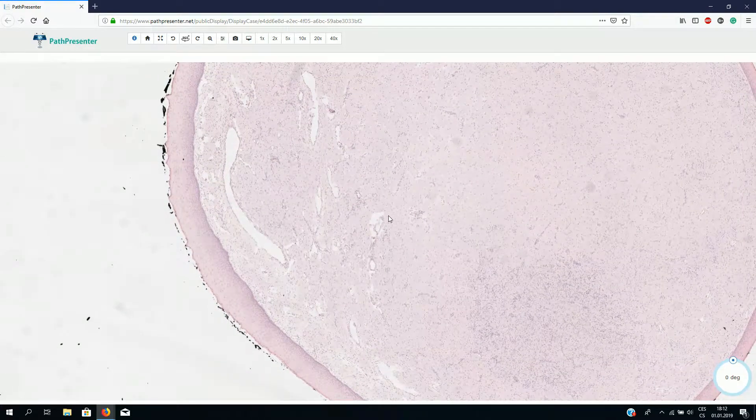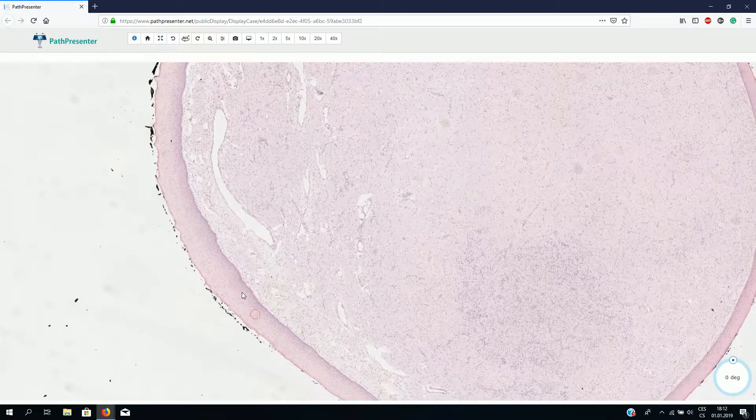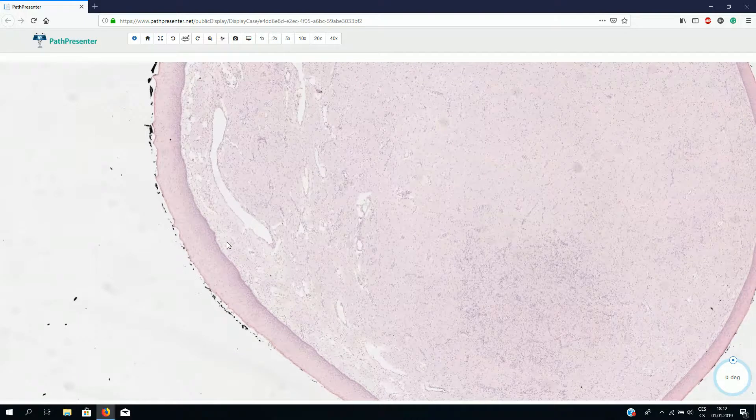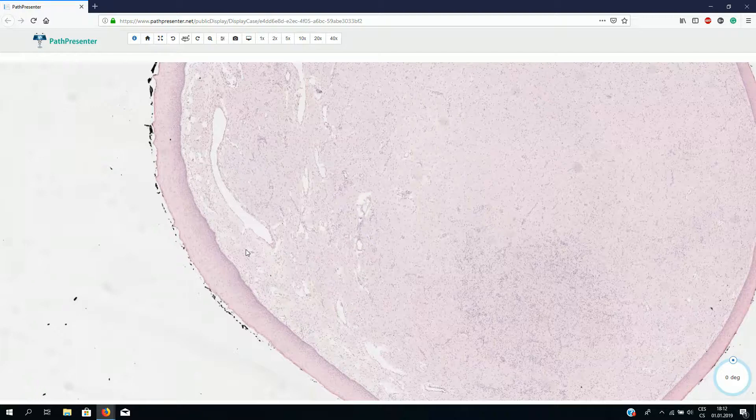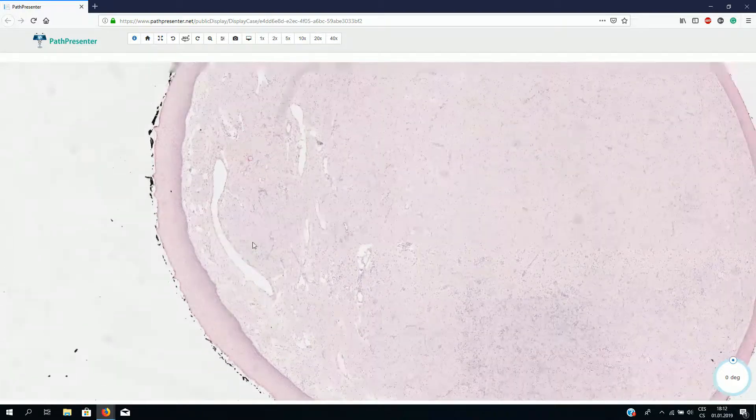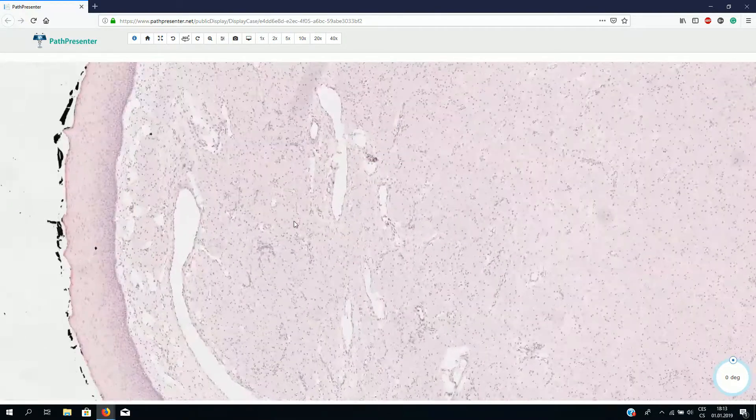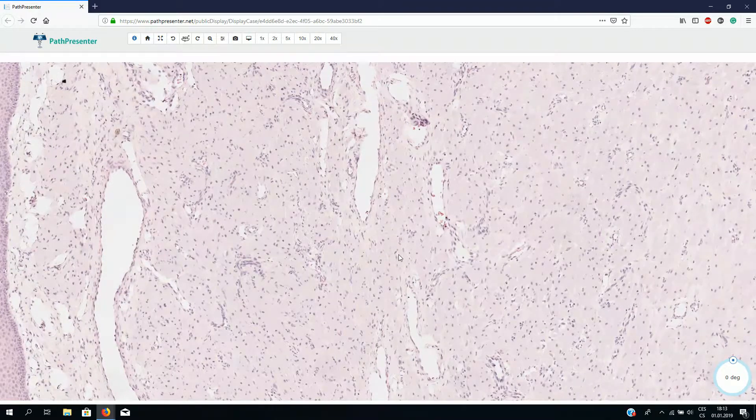On the surface, there is non-keratinized stratified squamous epithelium which is quite uniform. We do not see any rete ridges or pseudoepitheliomatous hyperplasia, and underneath the epithelium we can see uniform large cells.